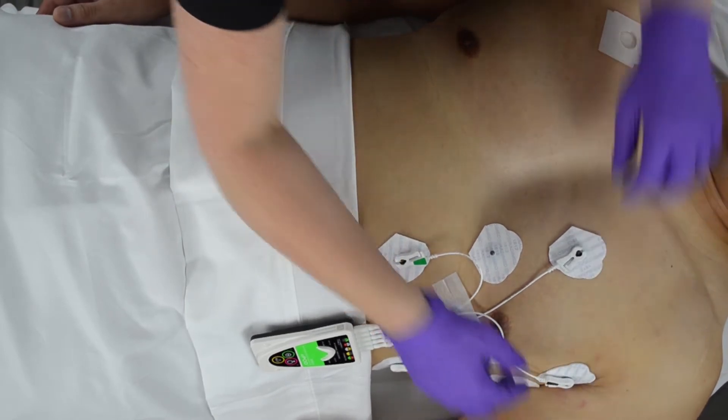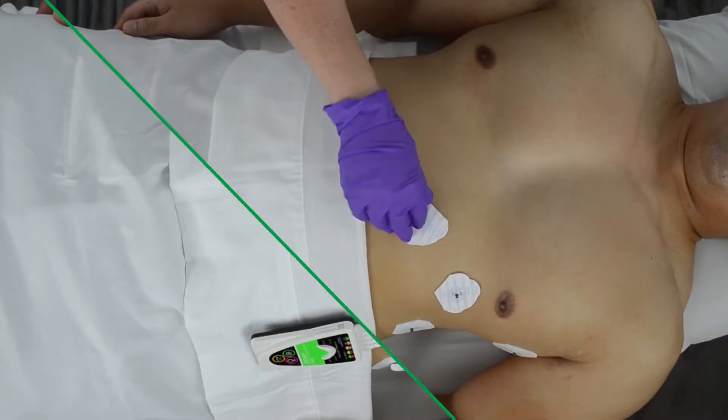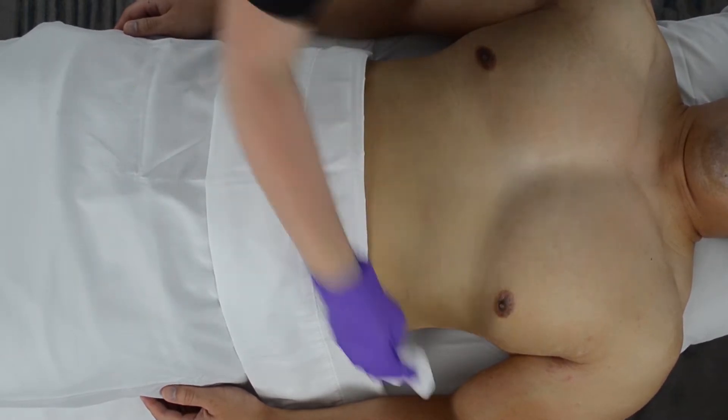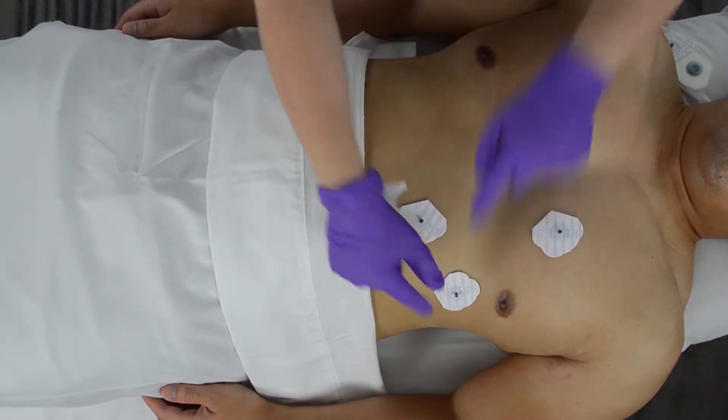If the ECG amplitude issues continue, the user will remove all electrodes from the patient, reprep the patient's skin, and reapply new electrodes.